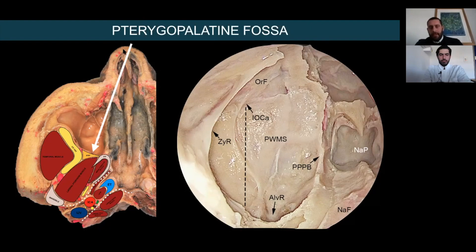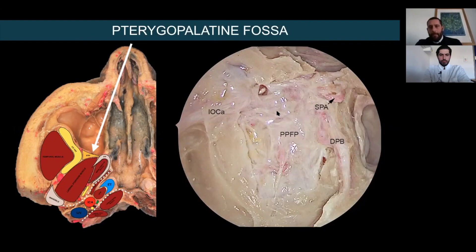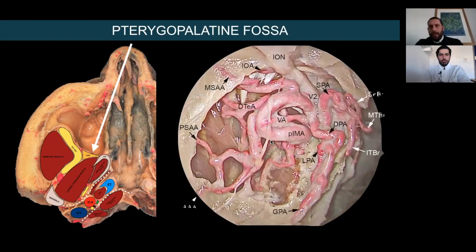We start with the pterygopalatine fossa. We open the sphenopalatine foramen — the only access to the pterygopalatine fossa. With Kerrison punches we remove all the bone. Always preserve the periosteum first, as this is an avascular plane allowing bloodless dissection. This is the sphenopalatine artery and the descending palatine bundle. Behind the periosteum — which we now open — you have the fat, vessels, and nerves. After removal of the fat, you can see all the anatomy of the maxillary artery and its branches, including the vidian artery heading toward the vidian canal deep in the pterygopalatine fossa.